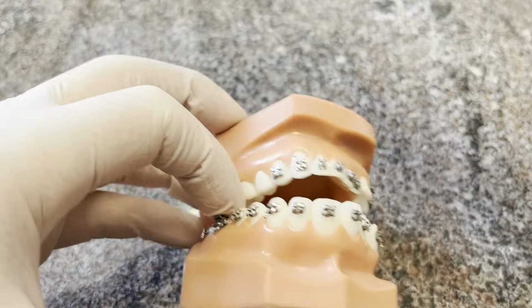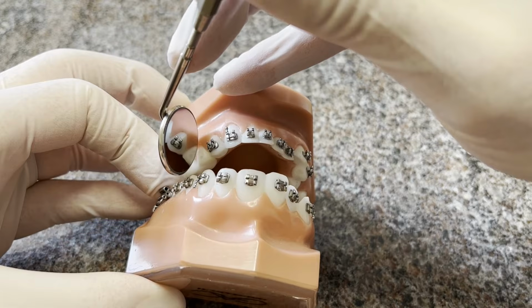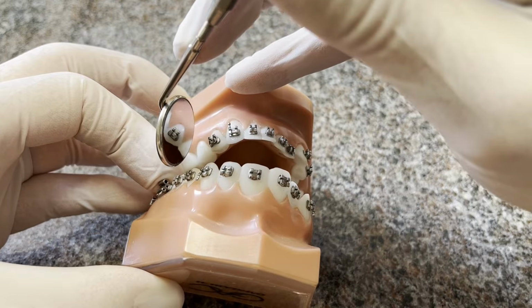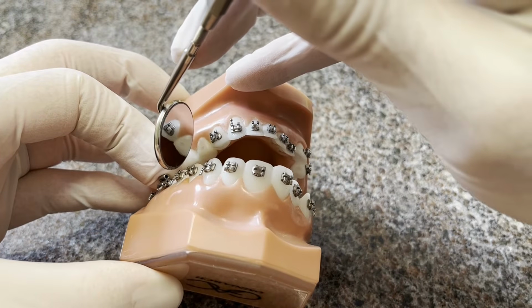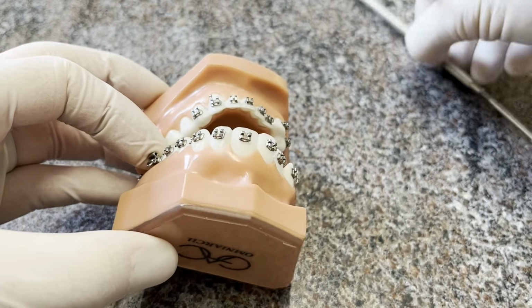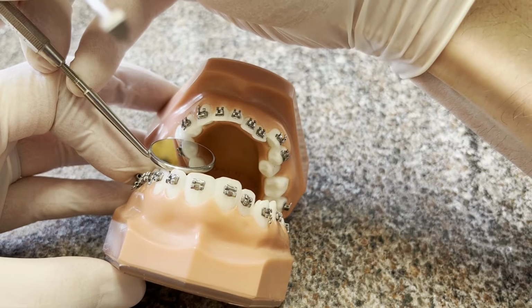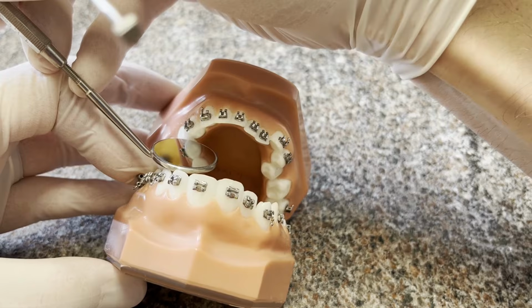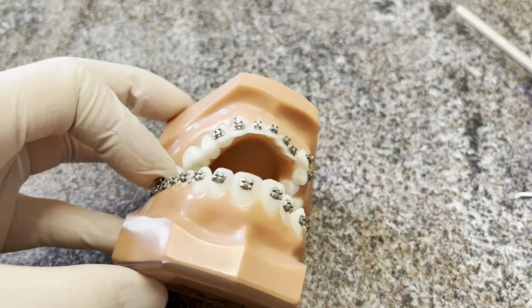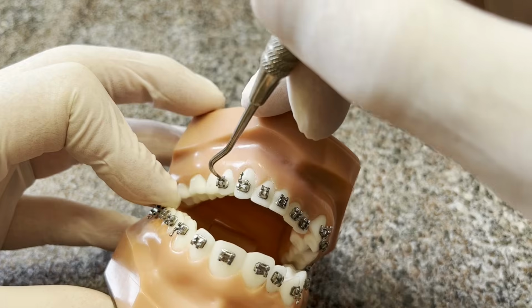take a look at it from the buccal in this mirror, and you want to check that the slot where the wire goes is parallel to the imaginary line connecting the two marginal ridges. That sets your tip. And then you'll take a look from the occlusal to check your rotation. So you look at it from the occlusal with the mirror to make sure that the bracket is straddling the height of contour in the middle. And then you eyeball it from the slot on the 6, which isn't present, but you would basically get an idea of where it should be.